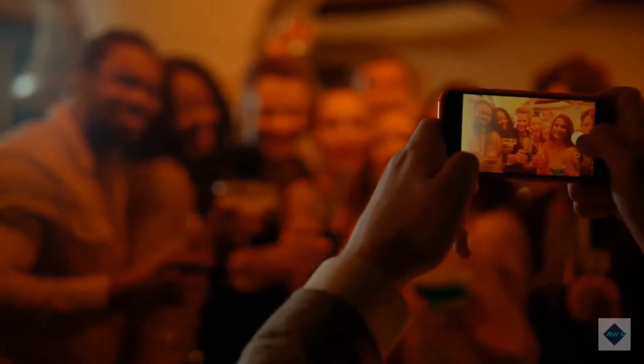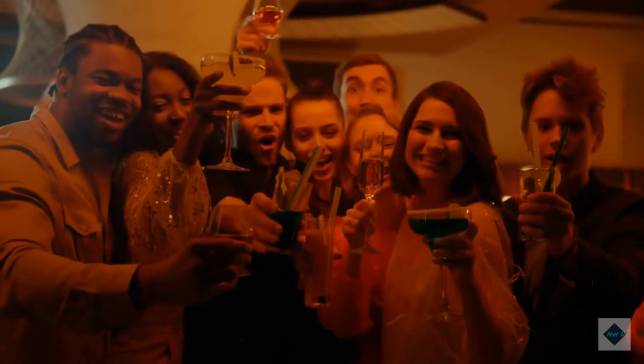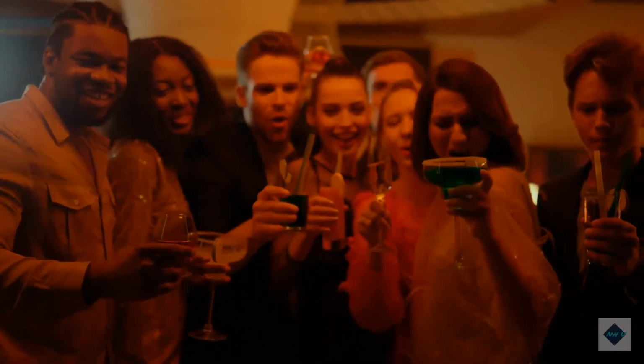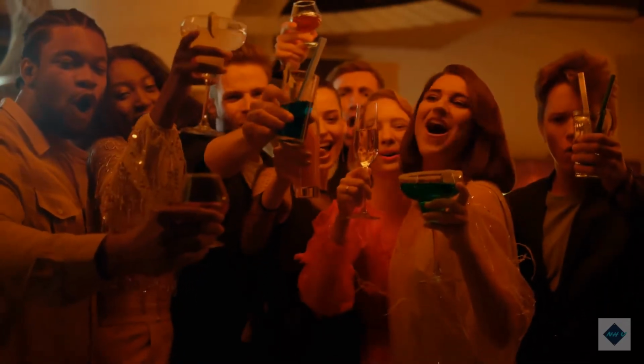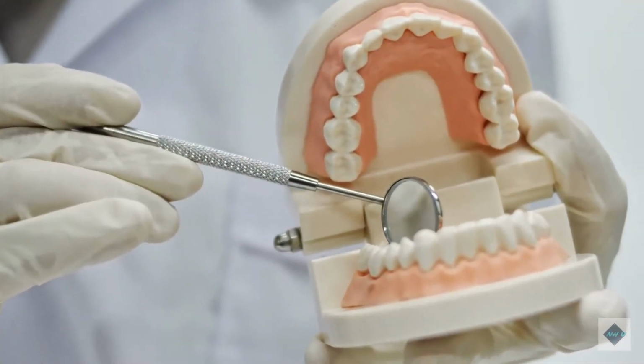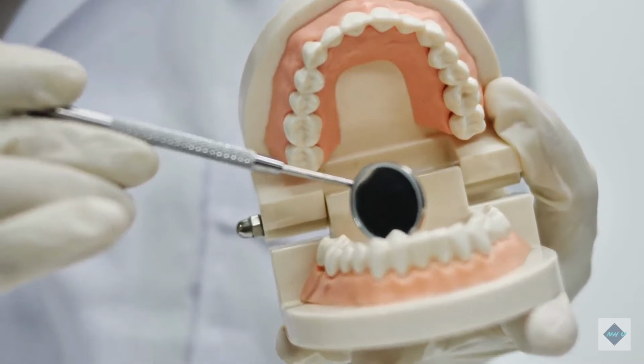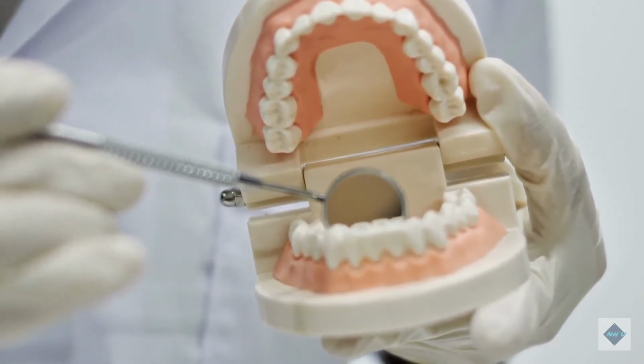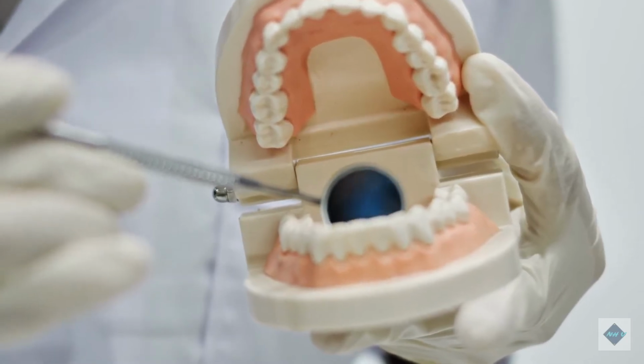gingivitis and dental plaques. The team, led by Ruokang Wang, a UW professor of bioengineering and of ophthalmology, combined a smartphone case modification with image processing methods to illuminate bacteria on images taken by a conventional smartphone camera. This approach yielded a relatively low-cost and quick method that could be used at home to assess whether potentially harmful bacteria are present on skin and in the oral cavity.